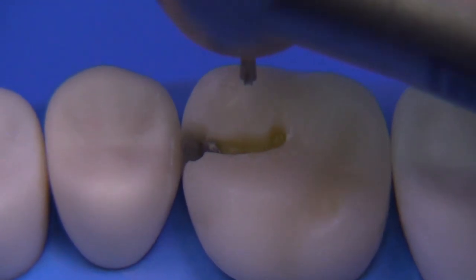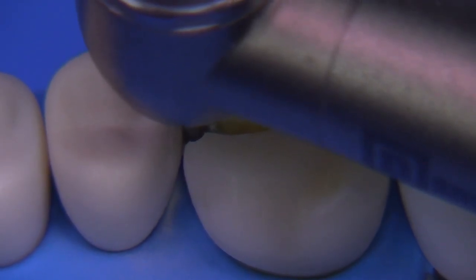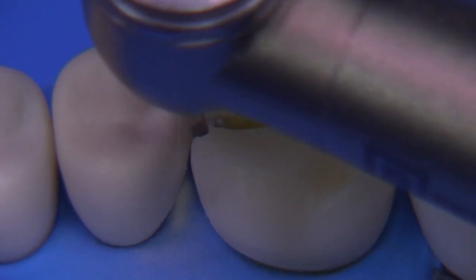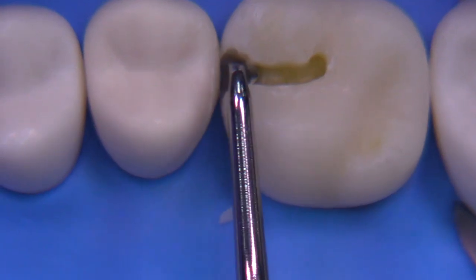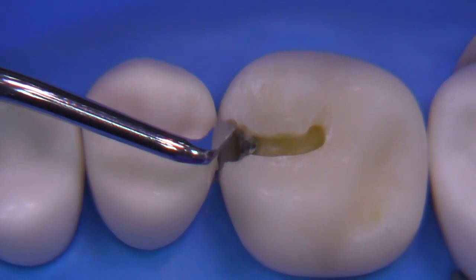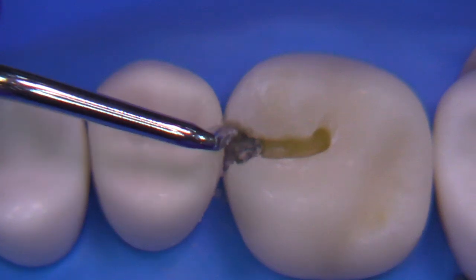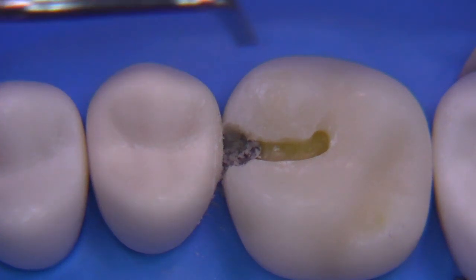A little bit more with the 245 so we can break contact. This video is going to show you two different approaches for the class 2: one is to just barely break contact, which is what I would typically do clinically. However, on many board examinations they want you to break the contact significantly more than that. So here I'm doing the little Sturdivant chip, where I'm knocking off the gingival lip of undermined enamel, and then with the 10-714 starting to get a little bit more extension on the facial-lingual. This is the very first time I've worked on this tooth.